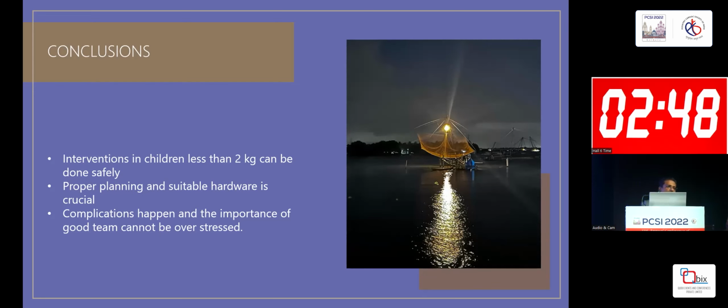Do you take an arterial line for your PDA devices in preterms? No. And for PDA stenting, if there is LPA stenosis, either at the origin or the LPA is smaller, would it be advised to go ahead or send them for surgery?